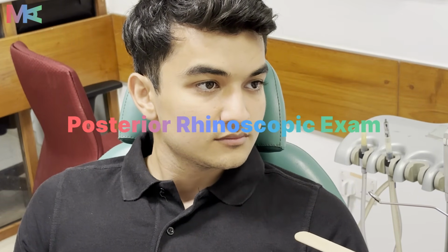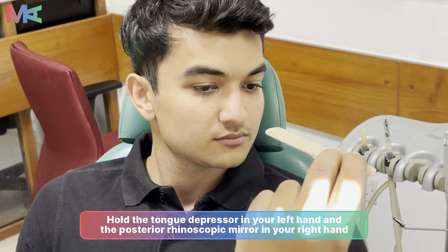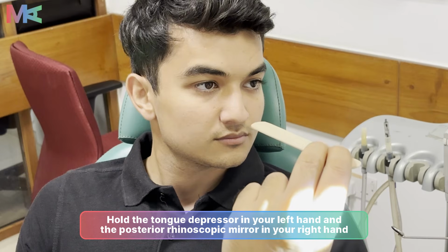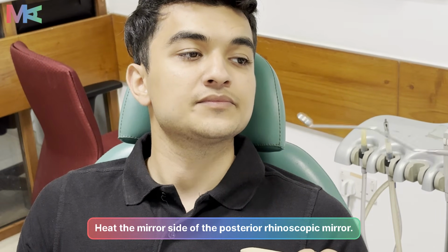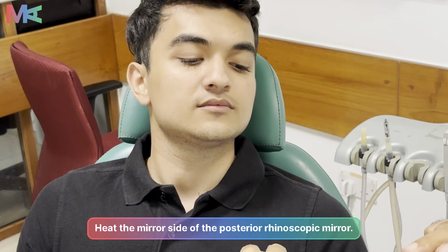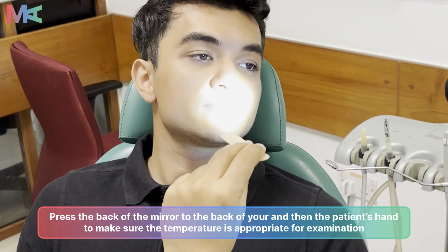So we'll be starting off with posterior rhinoscopic exam, and in order to do that, you should be holding this tongue depressor in your left hand and this posterior rhinoscopy mirror in your right hand. And the mirror is always pre-warmed before this examination and tested at the back of your hand and patient's hand.